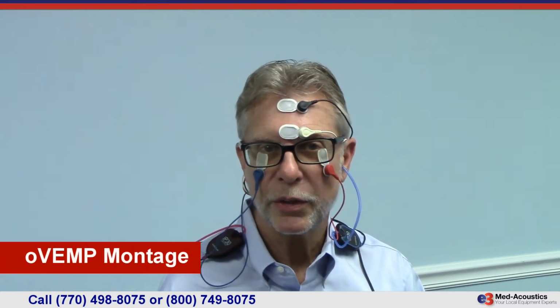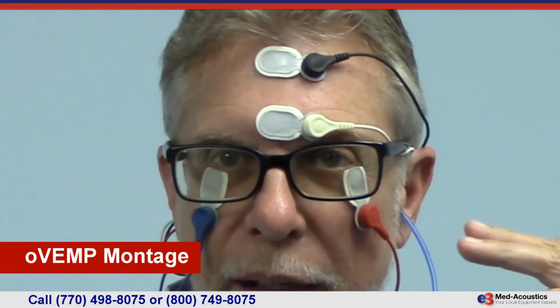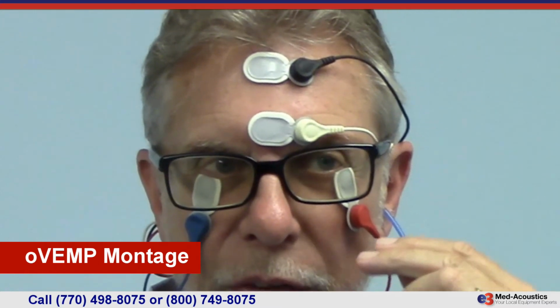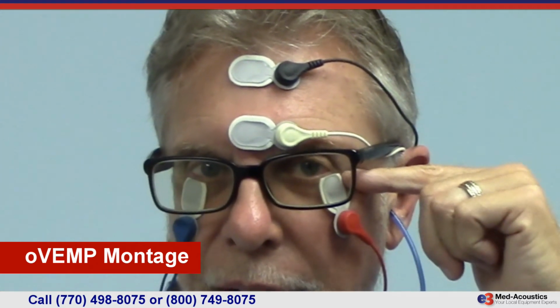So this is the electrode montage for the VEMP, the ocular VEMP. And there's a couple of things to note about this. First of all, notice the position of the two reference electrodes. Notice that the electrodes have been cut so that we could get the recording portion of the electrode as close to the eye as possible. And it's under the eyes, but it's not directly in the center. It is offset to the outside, halfway between center and the edge of the eye here. Okay? Why is that? Is because that position gives you the maximum amplitude.